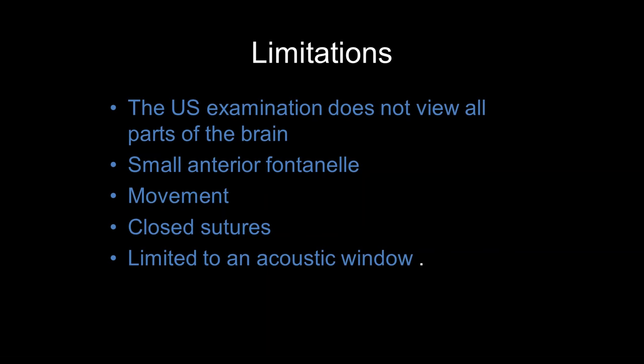The bigger and bigger the ventricles are over 6 millimetres, the higher the incidence of long-term neurological, motor, cognitive and neurodevelopmental delay. So you have these two things: is the ventricular dilation acute and related to the hemorrhage, or is it related to ex vacuo dilation, of which once again 3 millimeters is normal, 6 millimeters is not thought to show any, and 3 to 6 millimeters is not really associated with poorer long-term outcome, but once you get greater than 6 millimeters, it's associated with poorer long-term outcome in the ex preterm infant. And is thought to be, you know, ex vacuo dilatation in the infant who's got poor cortical growth.